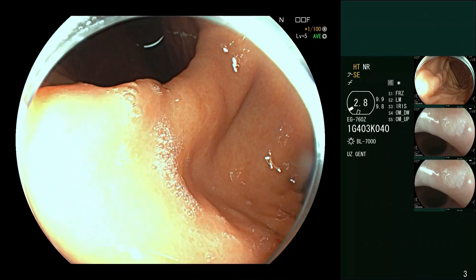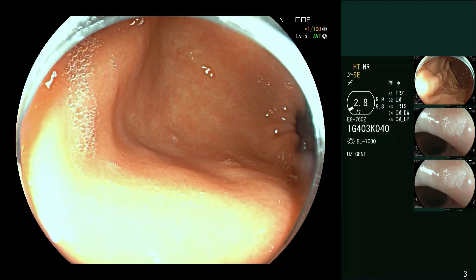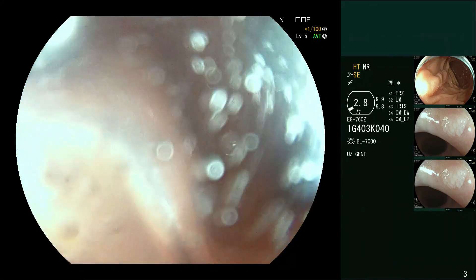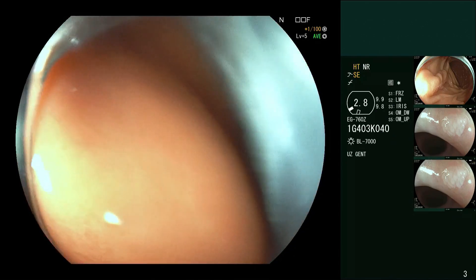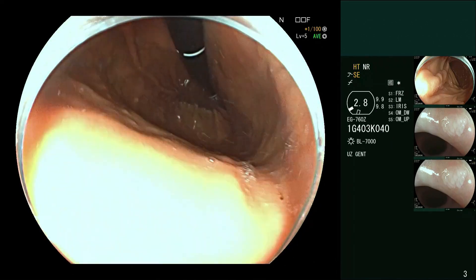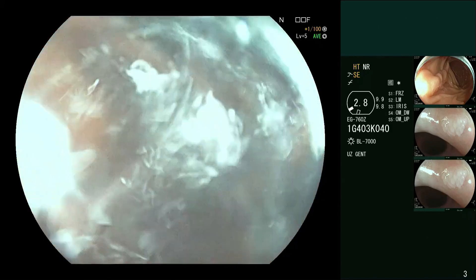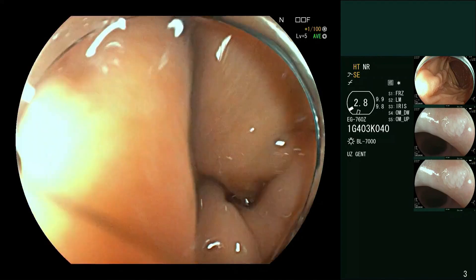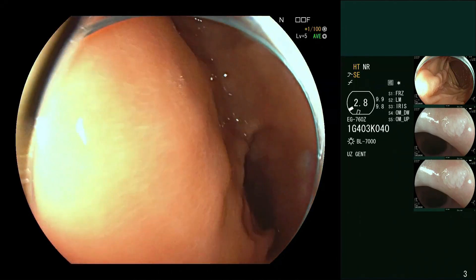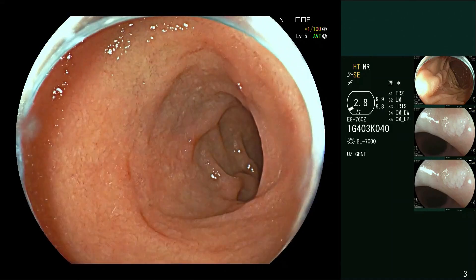Here we've also got a bit more very adherent mucus. We're going to wash that off with simethicone, saving a little bit of this syringe for the duodenum so that we can demonstrate the whole thing. We now go to the duodenum and make sure we assess it thoroughly.